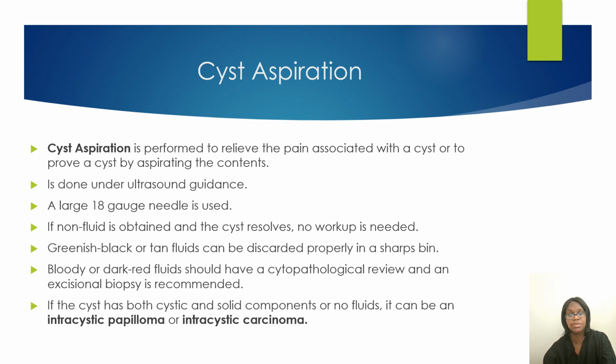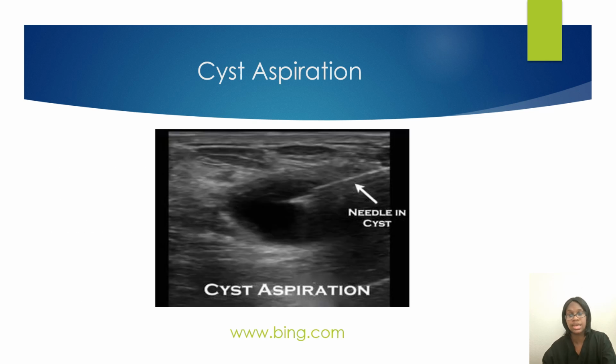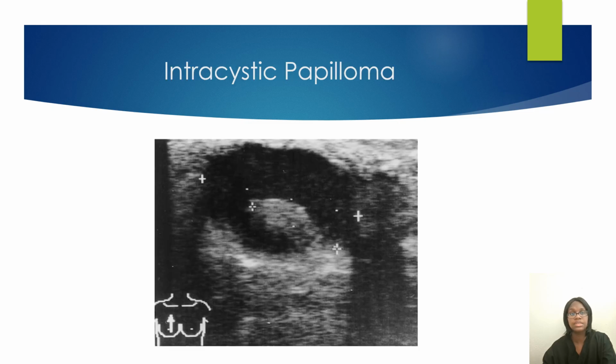For your cyst aspirations, if a patient comes in and they are uncomfortable, you're going to aspirate to get the fluid out to hopefully relieve the pain for the patient. This is an example of a needle going in for a cyst aspiration. This is an intracystic papilloma.